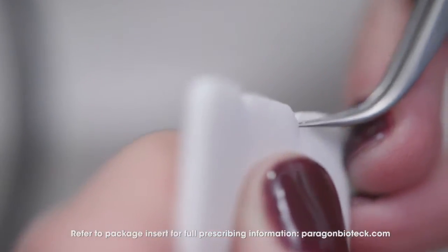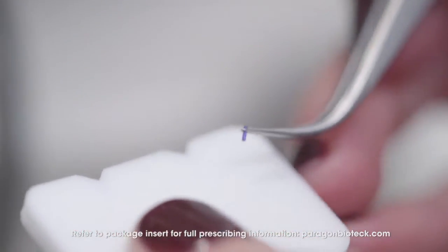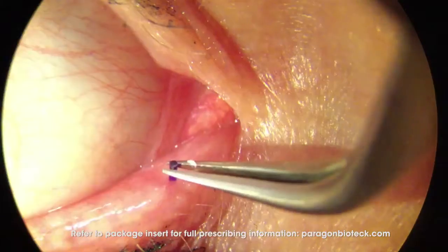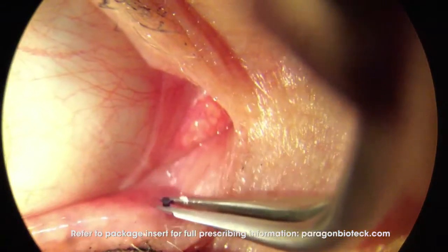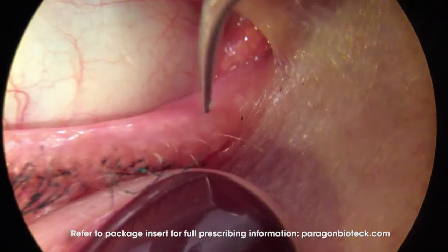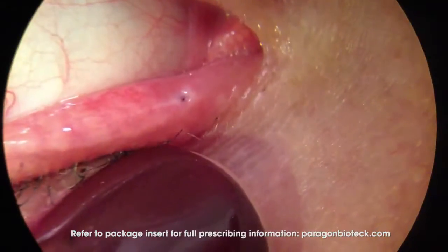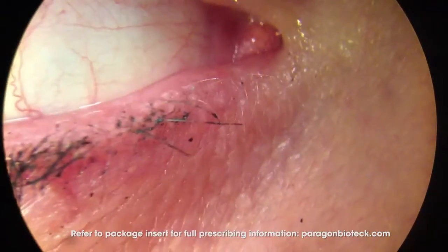After removal from the sterile pouch, use a jeweler's type forcep to remove one of the plugs from between the grooves in the foam holder. Then guide the plug partially into the punctum and release the forceps. You can use the tip of the forceps to push the plug out of sight into the horizontal canaliculus, so it's positioned approximately four to six millimeters beneath the punctum.